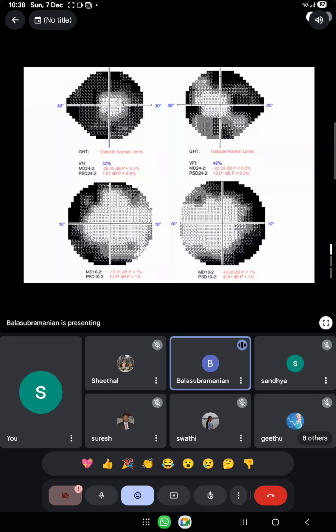That is just one sentence. You cannot come to a conclusion based on that. You have to do a serial interpretation of each data given in the chart before you come to a conclusion. This outside or within normal limits is not the diagnosis. You cannot ignore interpreting because of this statement. You have to go into the detail because you know the vision of the patient, the IOP, the fundus, all the other tests of the patient. The visual field machine will not know all this, so this is for you to interpret and not take for granted.